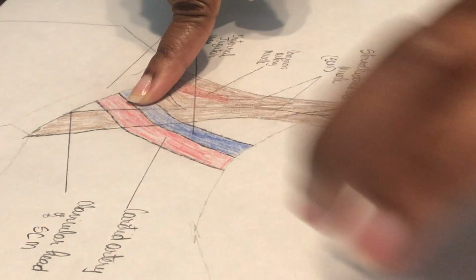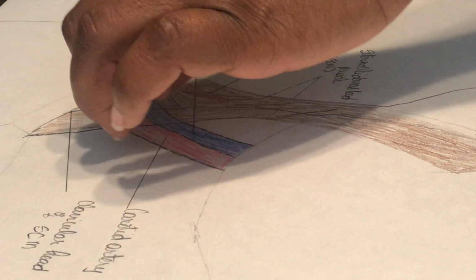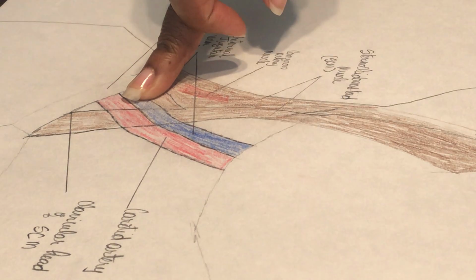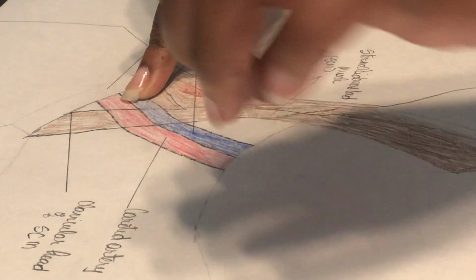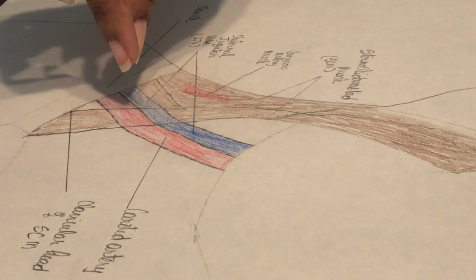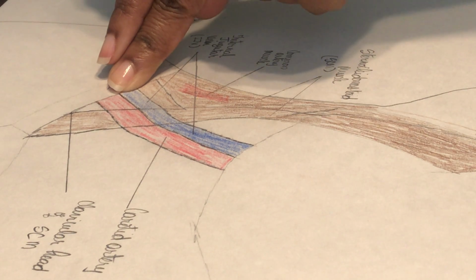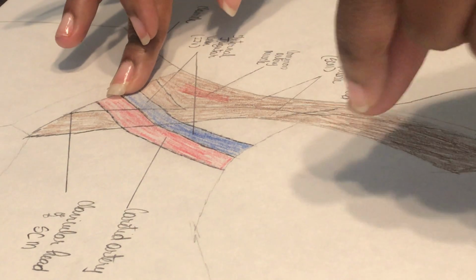So I slide it over my guide wire. Once it's in the skin, I insert it a little bit more until I see the tip of the guide wire out of the brown catheter. So now, while I'm advancing my catheter, I can remove my guide wire. Once it's in place, I insert it about 12 to 15 centimeters into the skin, and that catheter is marked. It's going to show on the catheter.